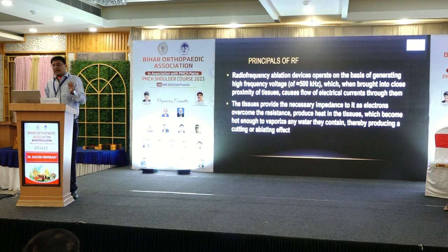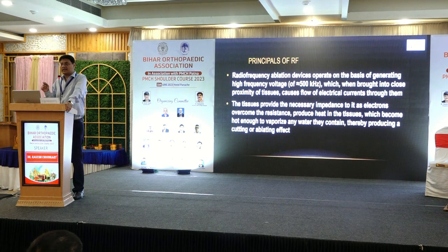So, a radio frequency device that we use operates on the basis that it generates high frequency, almost 500 kilohertz.